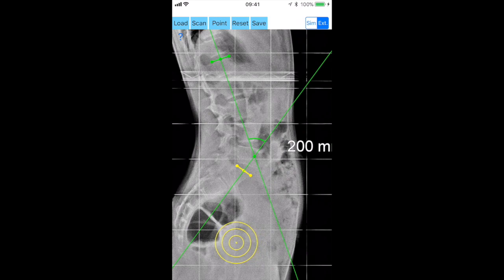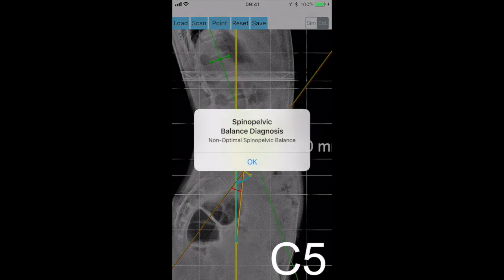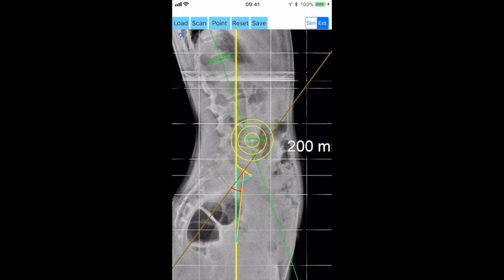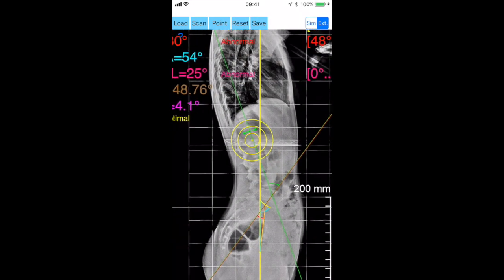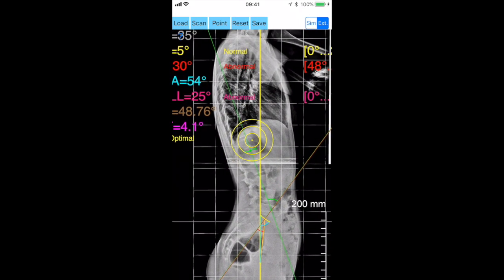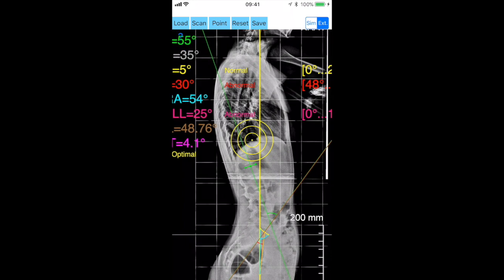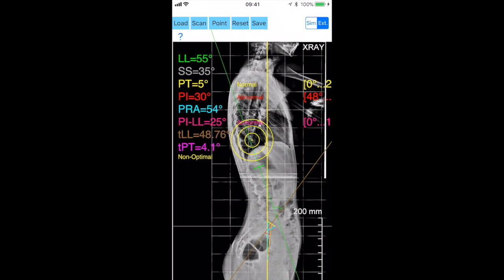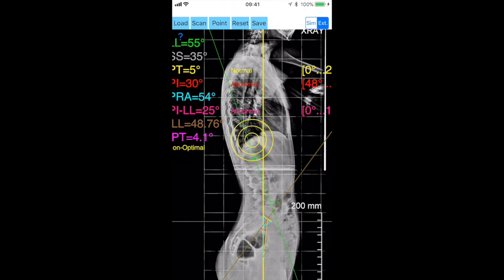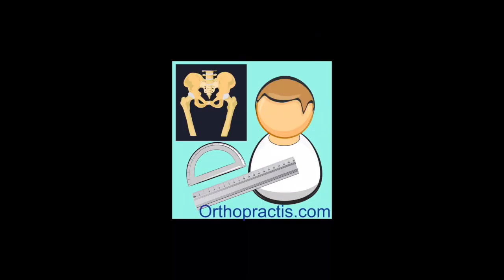Automatically the pelvic incidence angle (PI), sacral slope angle (SS), pelvic tilt angle (PT), lumbar lordosis angle (LL), pelvic radius angle (PRA), PI-LL pelvic incidence angle minus lumbar lordosis angle (LL), TPT, and TL1-S1 are calculated, and normal values appear respectively.